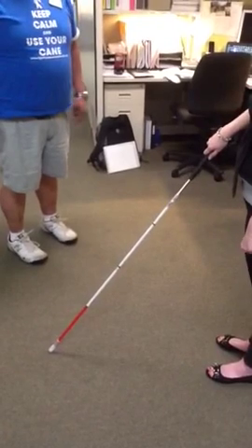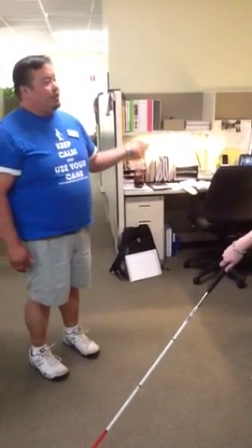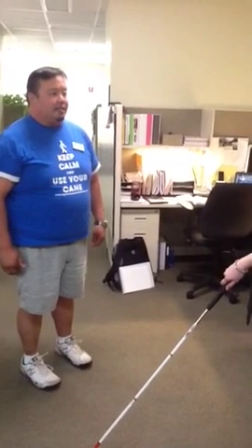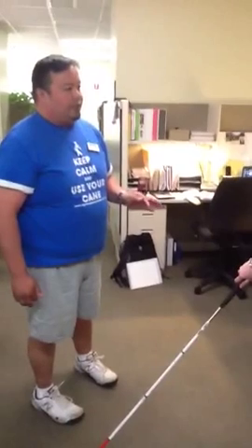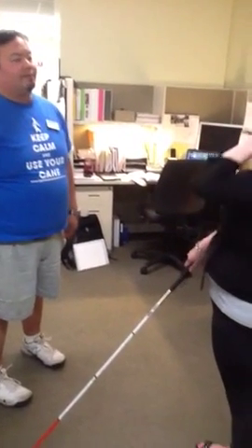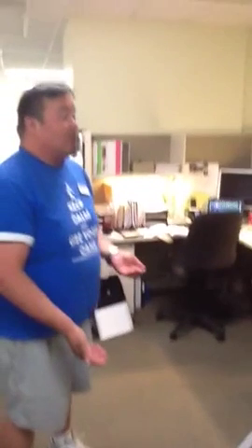Okay? What we're going to do right now is move into the hallway, and I'm going to let you go down the hallway using the diagonal technique. Okay? Which side of the hallway should you always travel on? The right or the left? The right. Why? Not sure. It's kind of like traffic on a road. Yeah, that's what I was thinking.